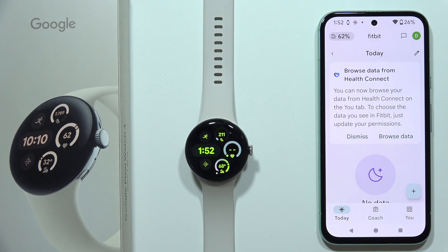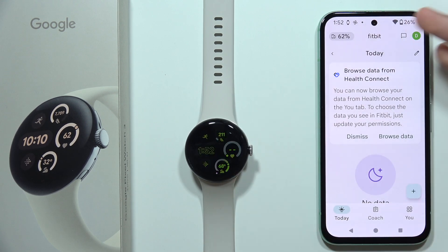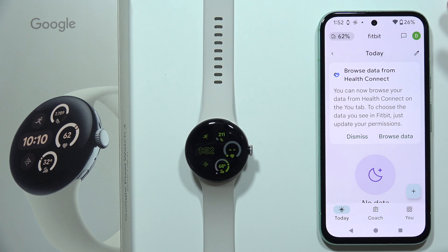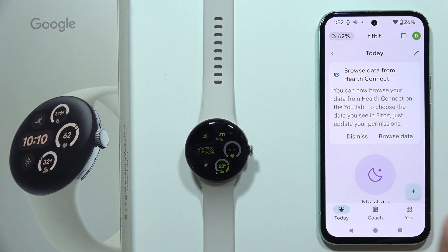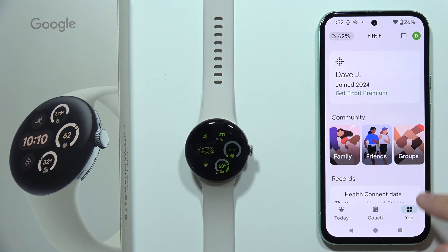To activate AFib notifications from your Google Pixel Watch 3, you will first have to open the Fitbit application on your phone and go to the 'You' tab in the right bottom corner.